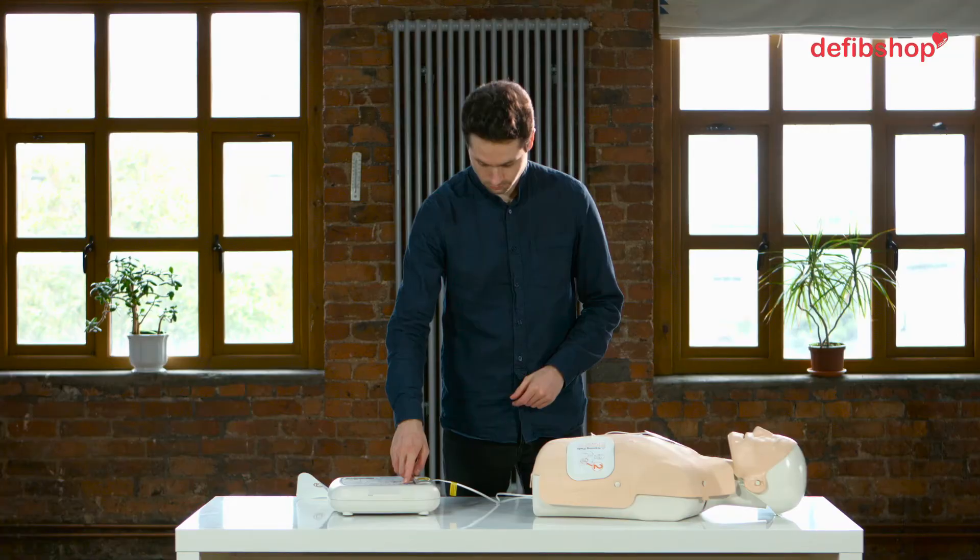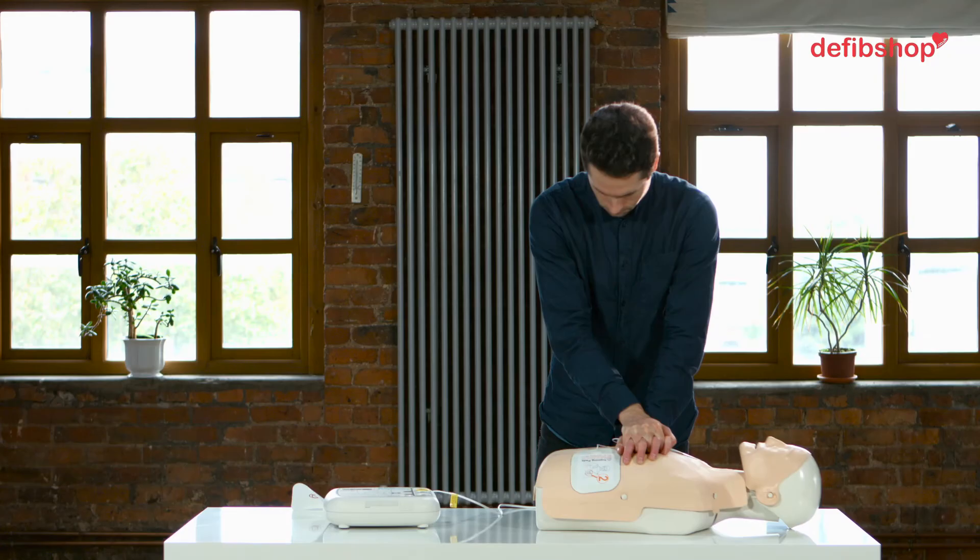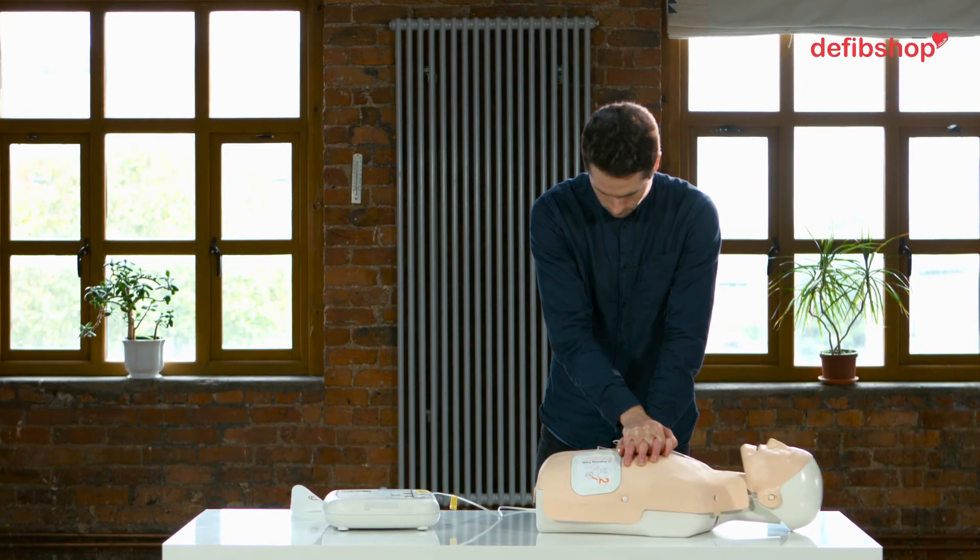Press the flashing blue eye button for CPR voice prompt. Place the heel of one hand on the centre of the chest between the nipples.